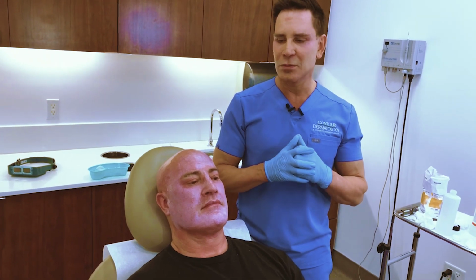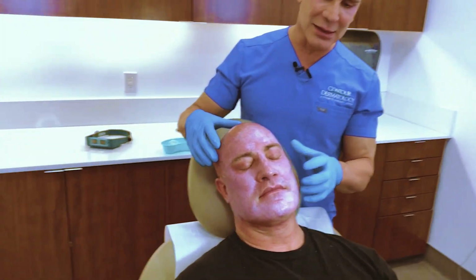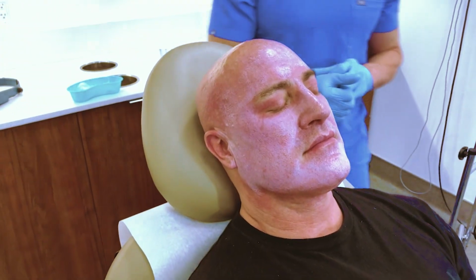And we do a lot more lasers right now because they're a little bit more precise. You can see his penetration is not completely regular, but it's pretty close, whereas with a laser we can be much more precise with what we're targeting.